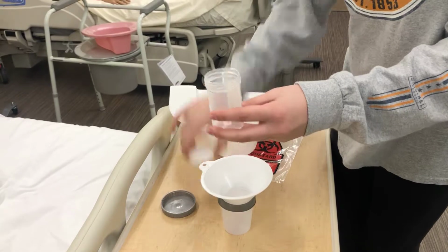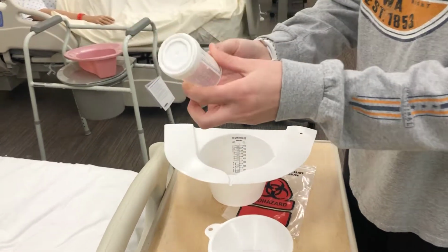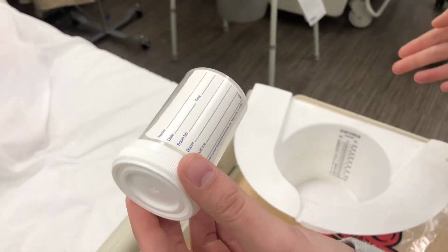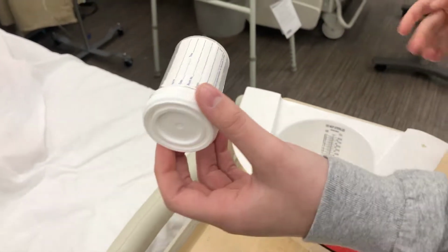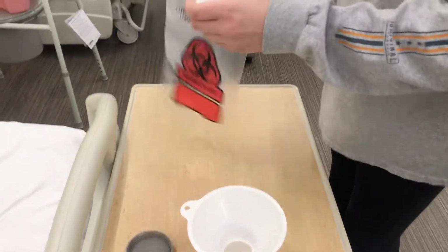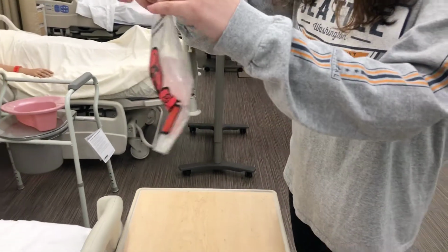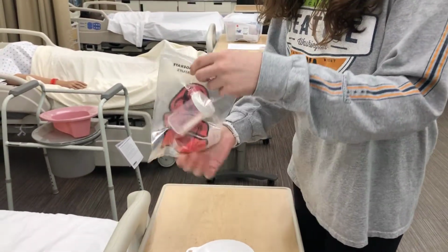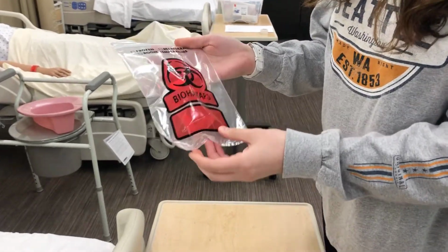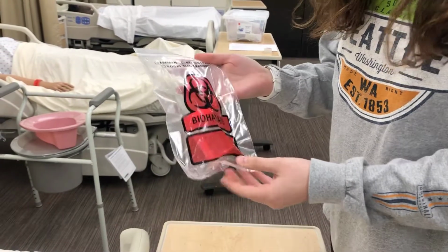Then I would cap it and fill out the information. I would label it with the patient's name, the date, the time, the room number, and their doctor. Then I would take a biohazard bag and put the specimen into there, and I would put the patient's name, their date of birth, the room number, the date, and the time.